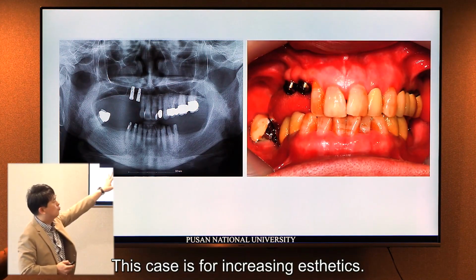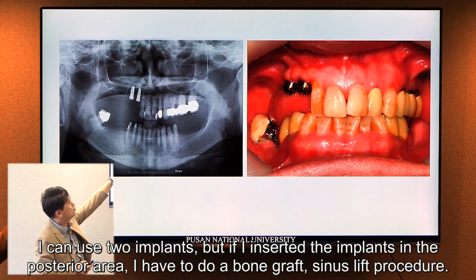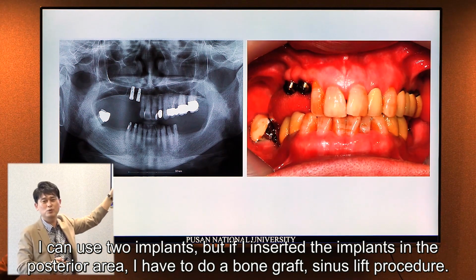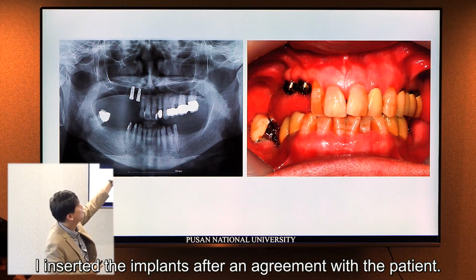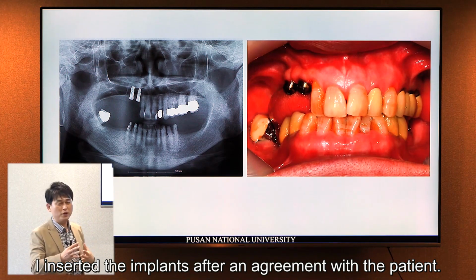This case is to increase the aesthetics. So I can use 2 implants, and if I insert the implant in the posterior part, I have to do the bone graft sinus lift procedure. At that time I couldn't do that. So I inserted implants after agreement of the patient.